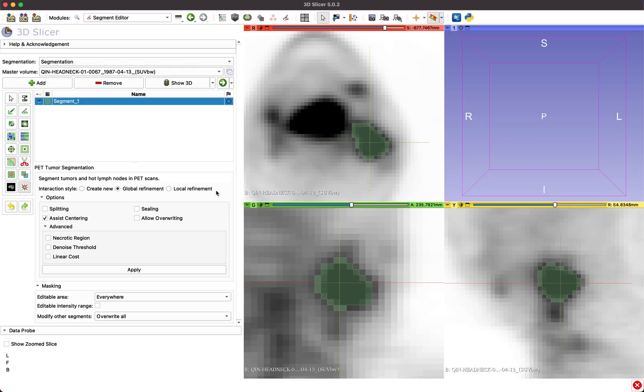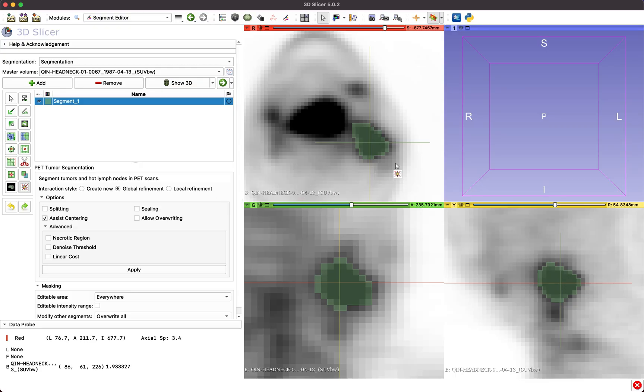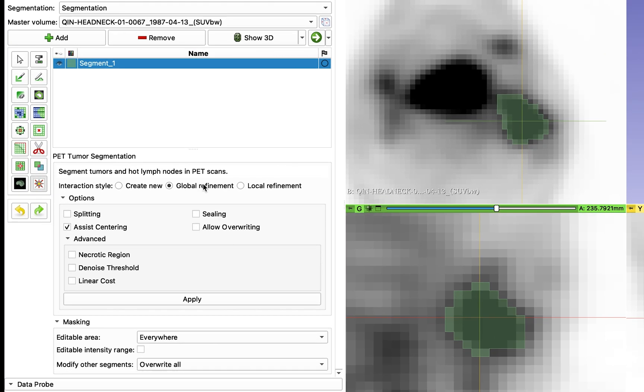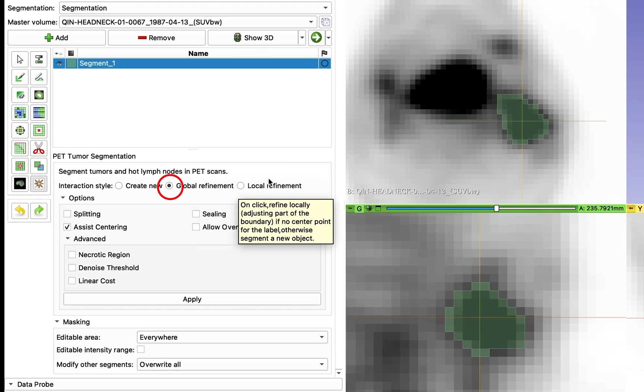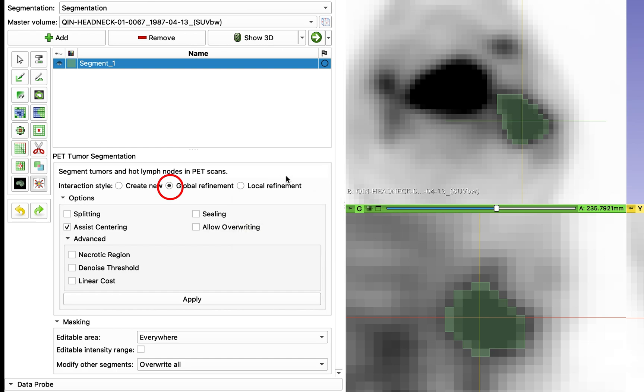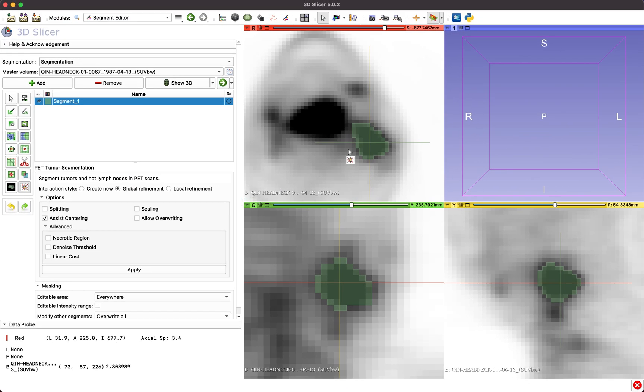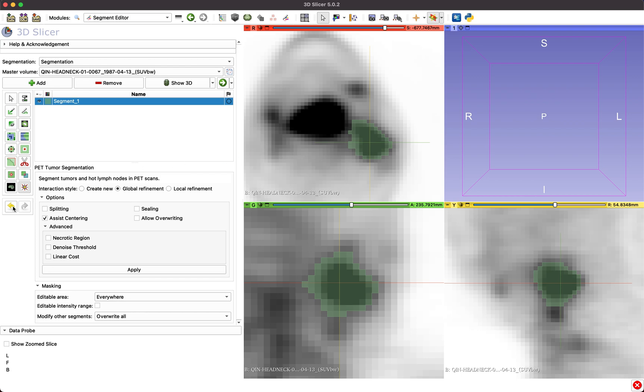The tool offers three interaction styles. In cases where the whole segmentation seems too large or too small, select Global Refinement and choose a point the new boundary should go through. This changes the whole boundary of the segmentation based on the grey value of the selected point.